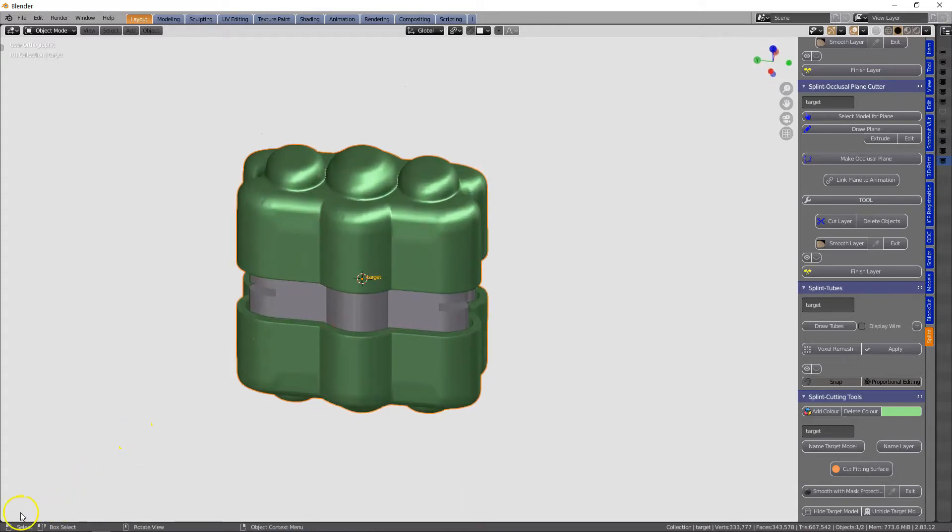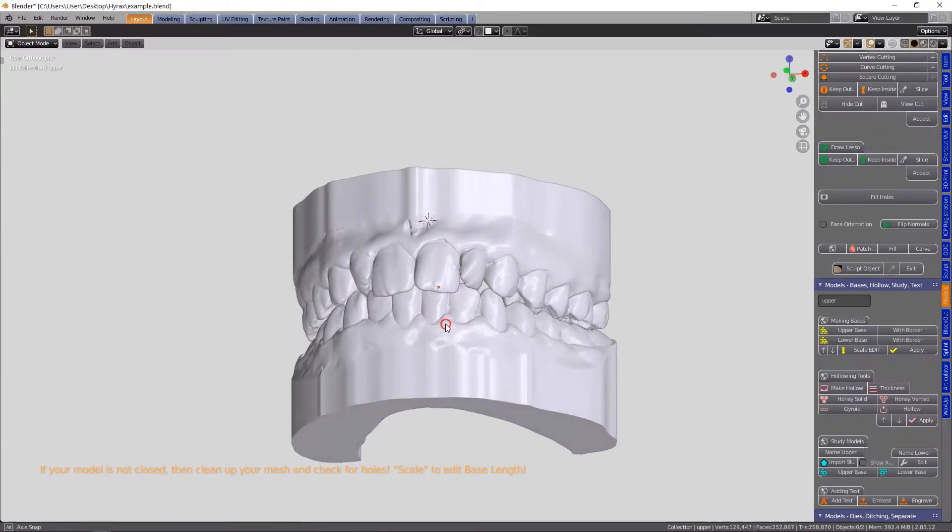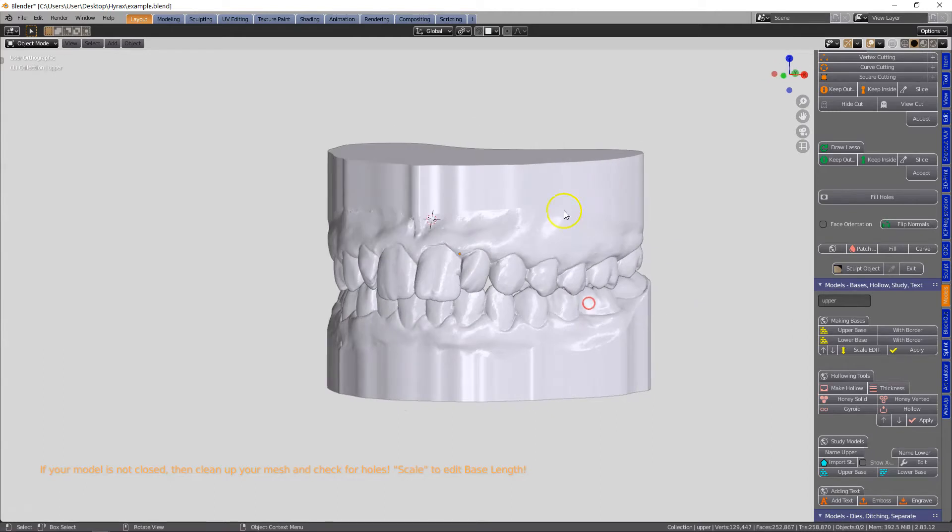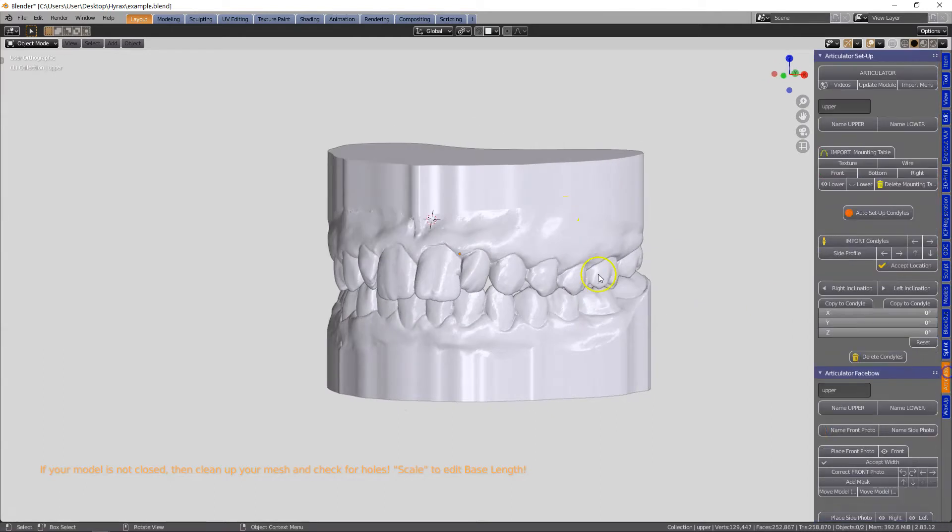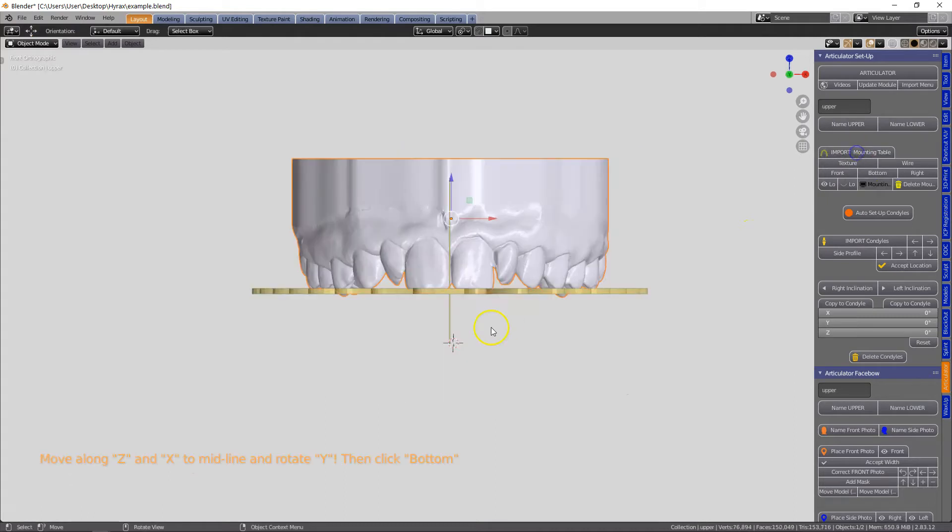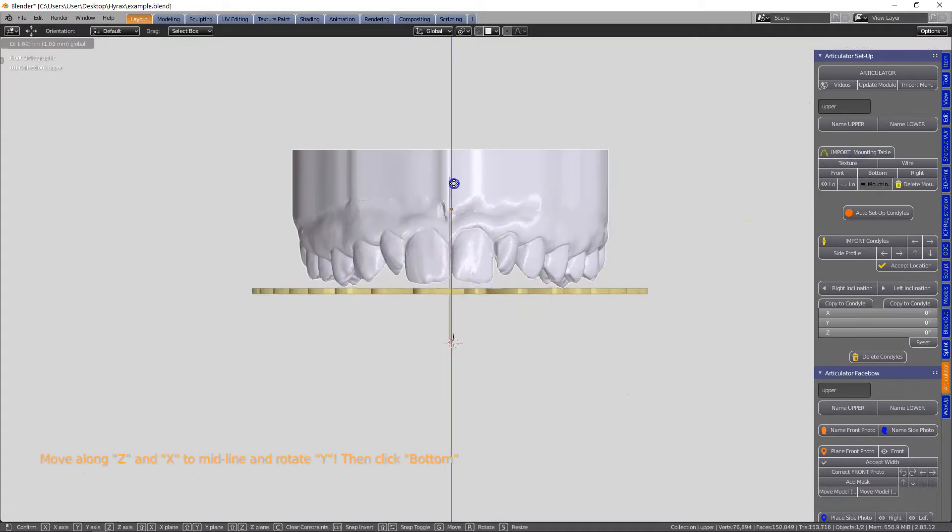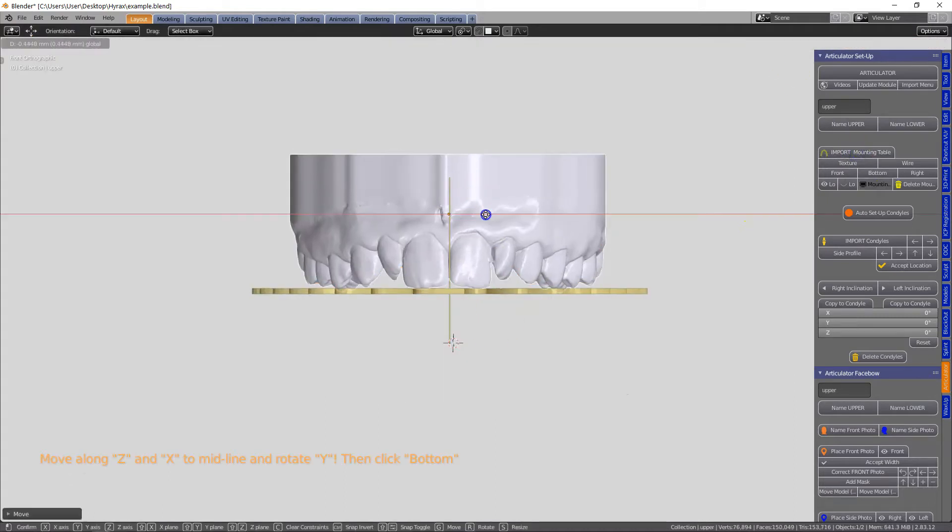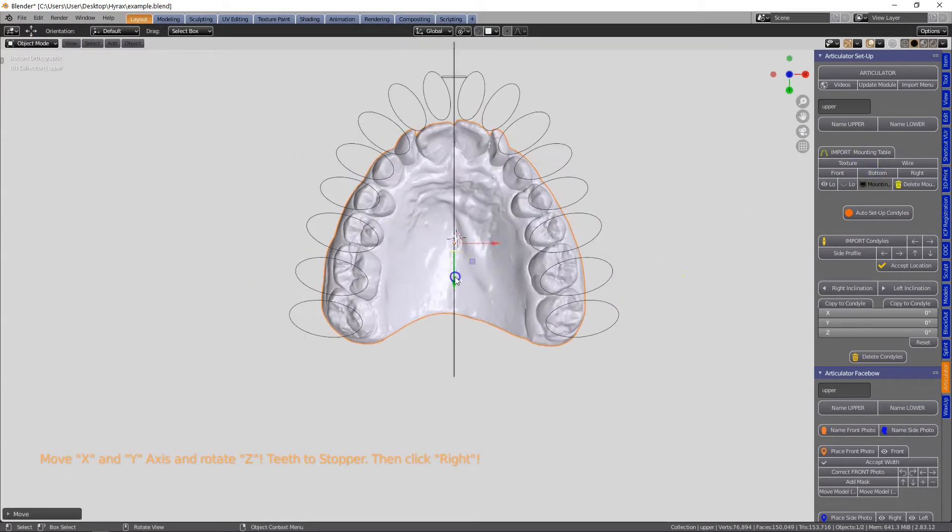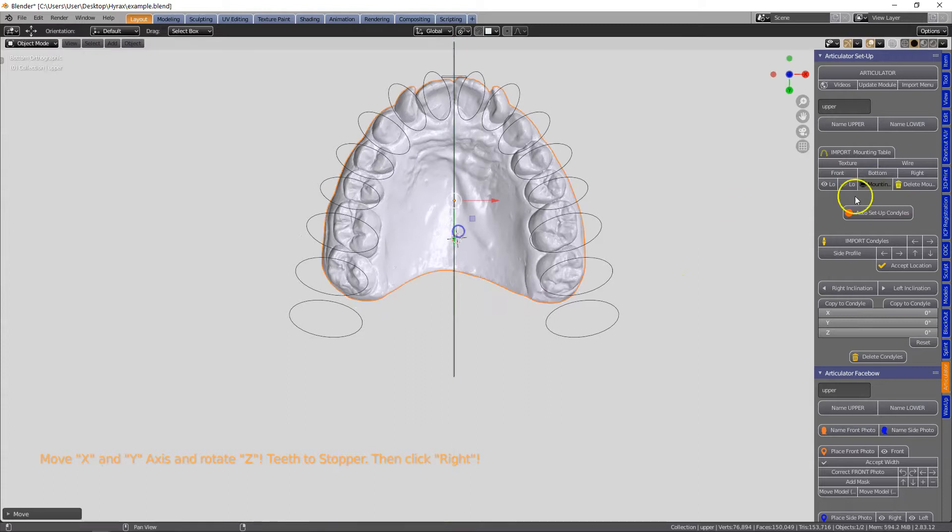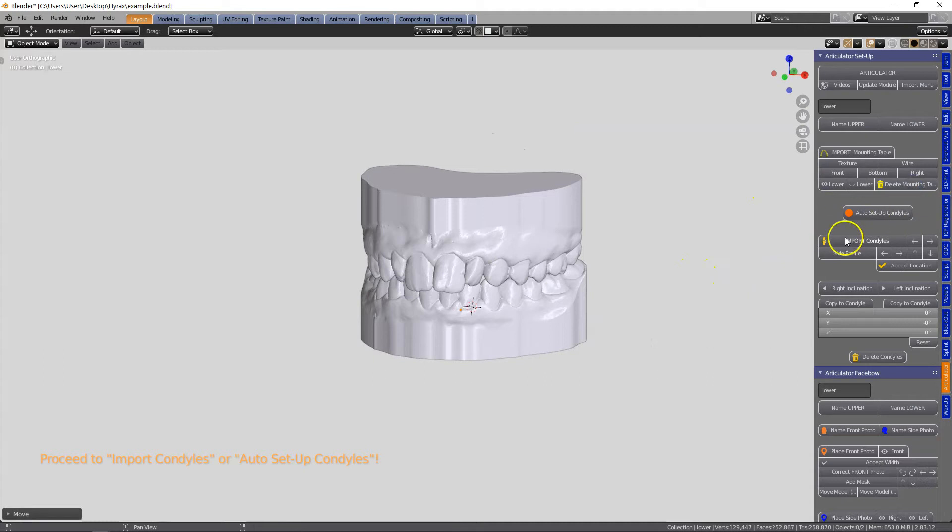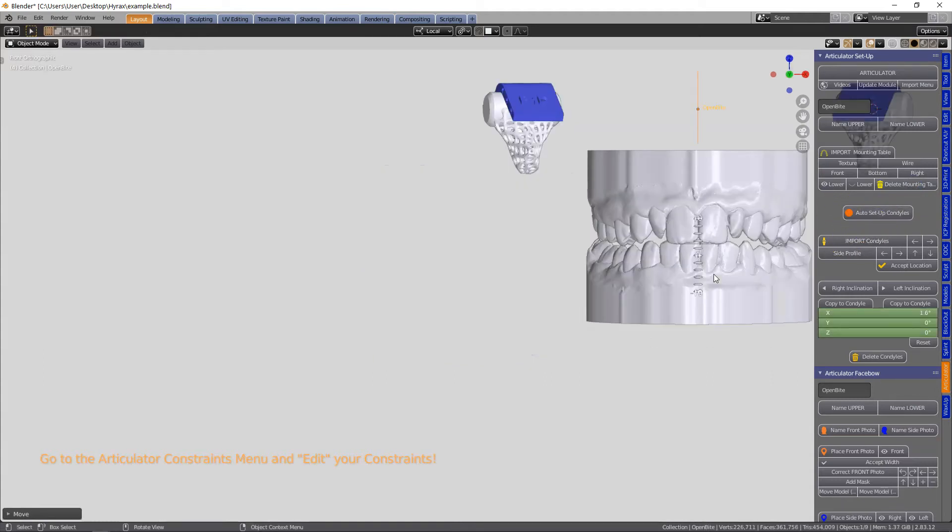In this video we're going to be making an orthodontic expansion device which we can then laser sinter in metal. First of all we've made the models in the model design and as you see over here we are mounting them according to the mounting plate on the articulator.